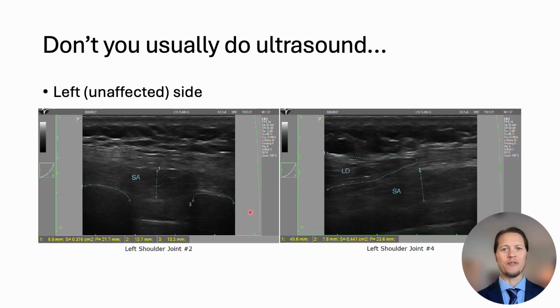Now, I know if you've been through this, all my students kind of say, hey, come on, where's the ultrasound? You're a big ultrasound guy. How come this hasn't come up yet? And well, here it is. This is my, well, still lower quality ultrasound. I'm waiting for the new one.